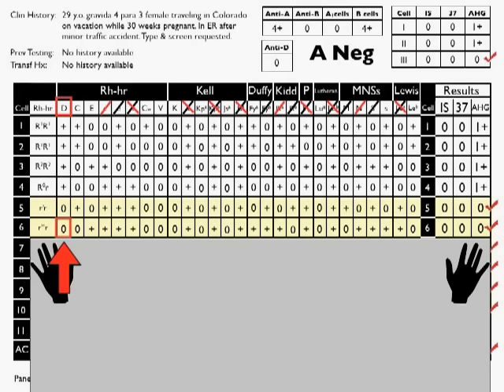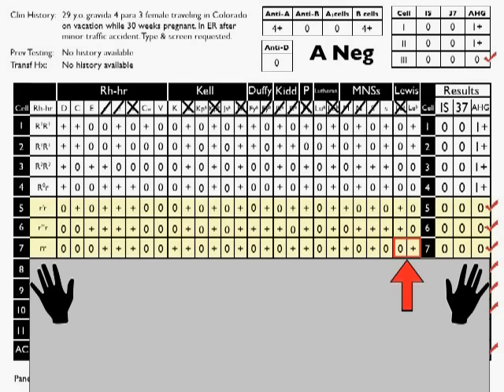Okay, here we have a double dose rule out for Lewis B. Great, single slash. Another double dose rule out for big S, single slash. A double dose rule out for M, single slash. We've already ruled out Lutheran B, nothing more to do. Already ruled out P, nothing more to do. Onto the Kidd system, and we have JKB, double dose rule out, single slash. We have Duffy B, double dose rule out, single slash. And we've already done JSB, we've already done KPB.